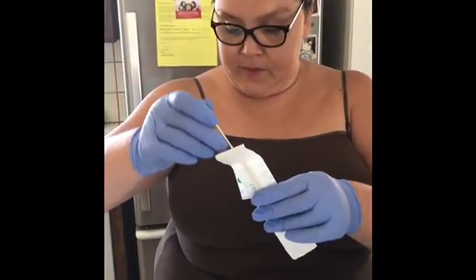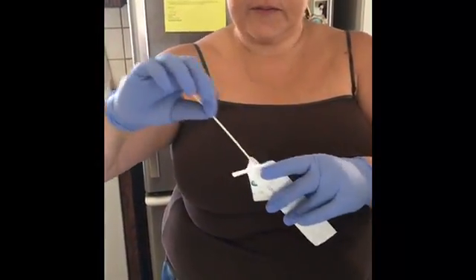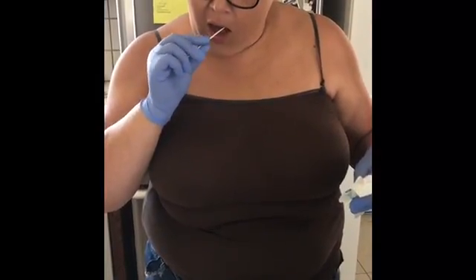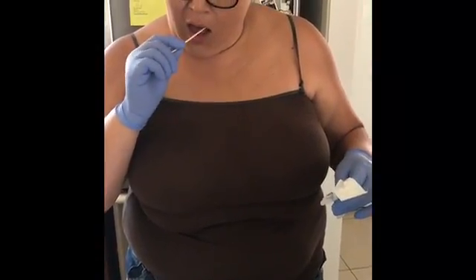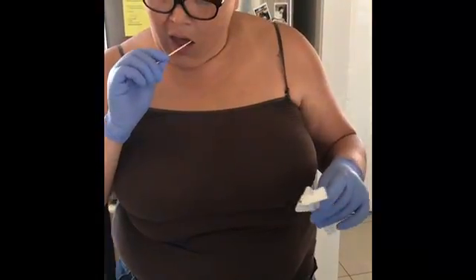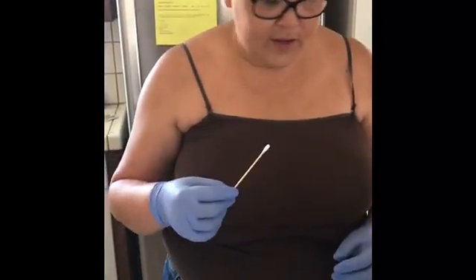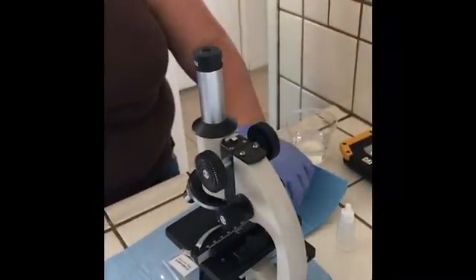So with one sterile swab, I'm going to gently scrape a few cells from the inside of my cheek. I got that. I'm going to smear the swab containing the cheek cells onto the microscope slide.